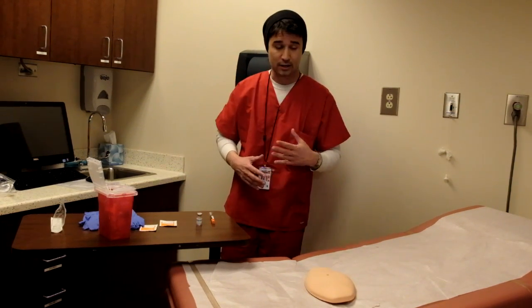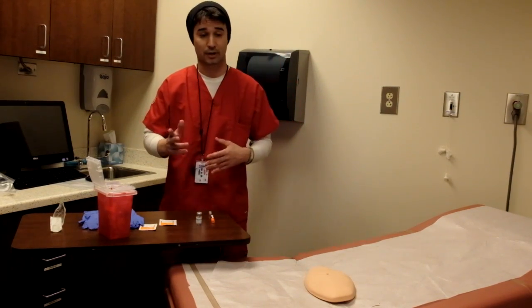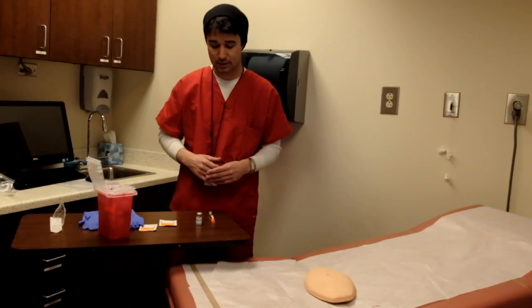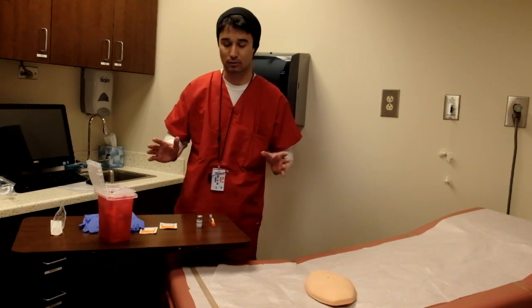I'll go ahead and check my seven rights when it comes to getting the medication, just to make sure that we're doing everything right.